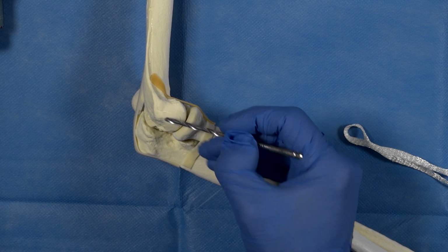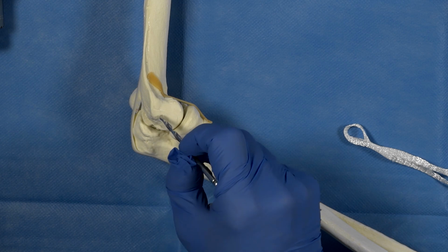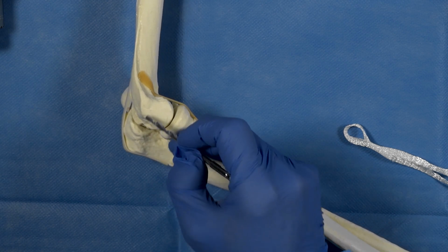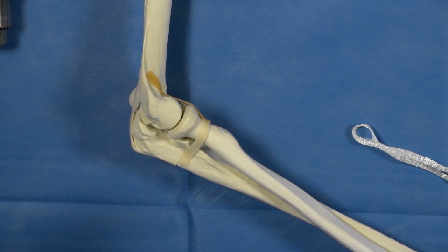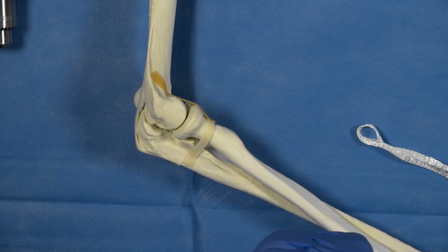You also, when drilling that humeral bone tunnel, need to think about the position of the graft. So if you want your graft to sit in this position, to arise from this position, you actually want to bring your hole just a little bit more proximal and posterior, because the graft will always sit at the inferior point of your drill hole. So you don't center your drill hole in exactly where you want your graft to be. You put your drill hole just slightly proximal so that the graft will then sit exactly where you want it.